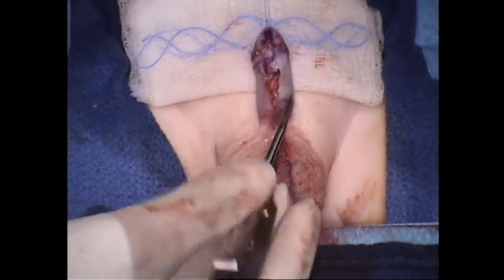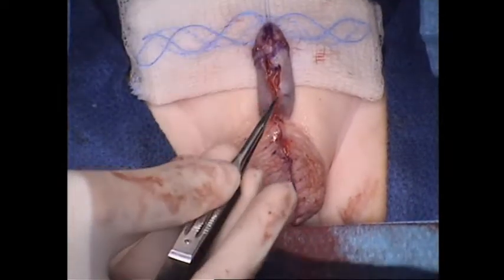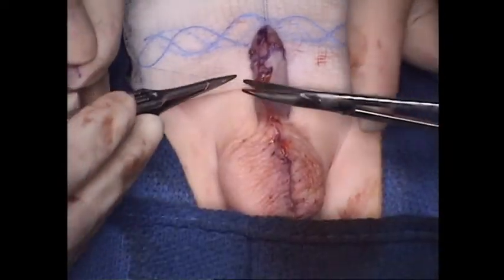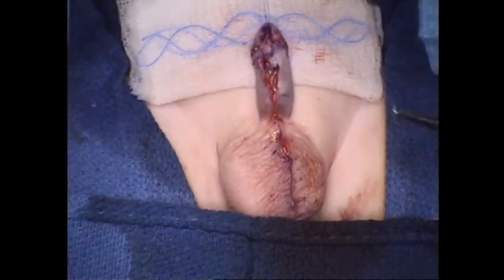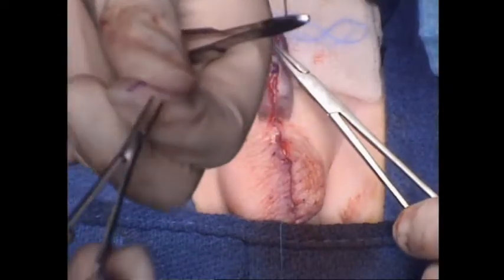And again, you'll see us doing these epithelial sutures here because, of course, we're going to be going right back through this at the next stage when we come around our proximal urethrostomy, so we don't mind doing an epithelial suture right there.